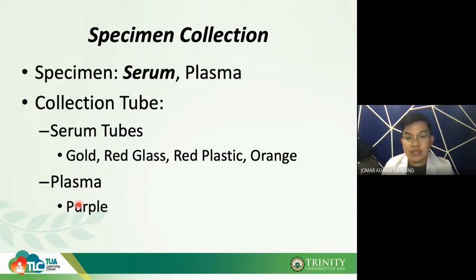So that is for your specimen collection. Of course, as prescribed by CLSI, the most preferred manner of collection is through the evacuated tube system, although you can also collect blood samples through a butterfly or wing infusion set, or a syringe system.